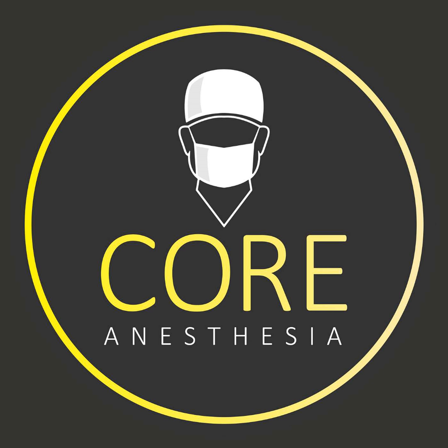The Mac blade is going to technically have less risk for trauma to the teeth, and it's also going to have more room for the ET tube to move past the tongue and actually get down to the trachea, just because the blade is curved and follows that natural anatomy a little bit better. It has a larger flange, so it improves your ability to actually sweep the tongue out of the way.